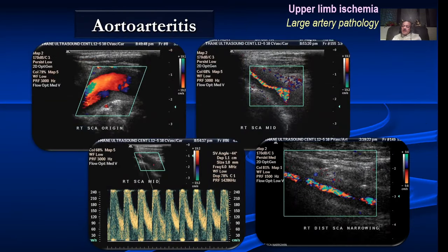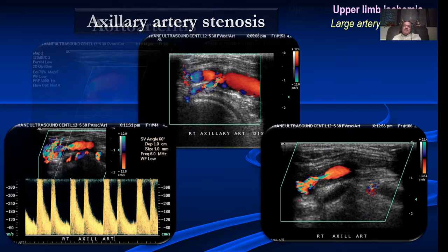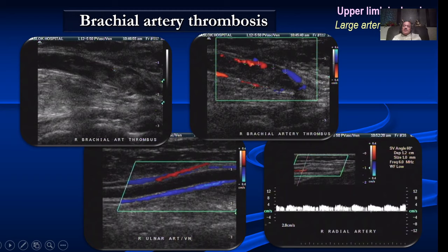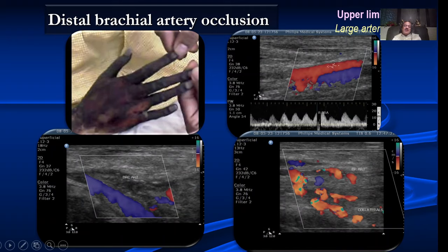Aortoarteritis is very common in the upper limb — the subclavian artery is very often affected, with a long segment of wall thickening and narrowing, which is very classical. We can have axillary artery stenosis with aliasing, narrowing of the flow channel, and very high velocities. We can have brachial artery occlusion — note the number of collaterals that develop in the upper limb. However, this patient had dampened flow — this lady had severe discoloration of the hand, and the cause was occlusion of the brachial artery, and both the ulnar and radial arteries were also occluded. A very severe case.